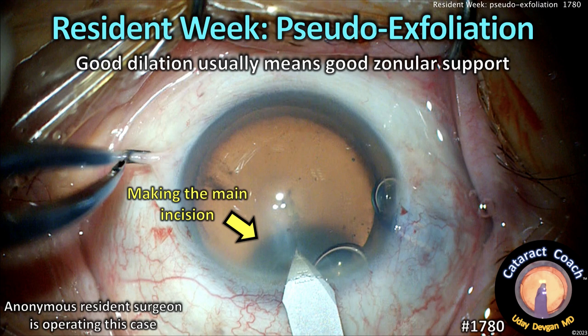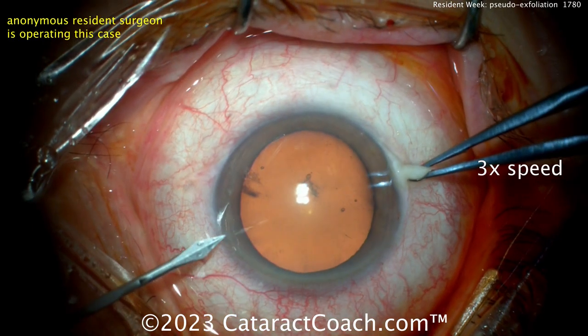CataractCoach.com, Resident Week. Pseudoexfoliation — good dilation usually means good zonular support. Let's watch this anonymous resident who's operating here.